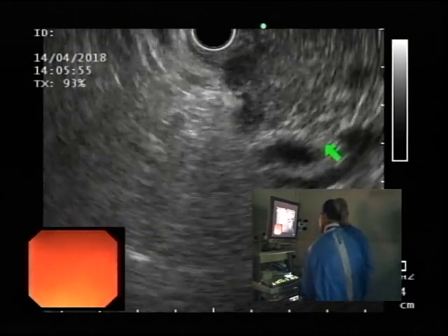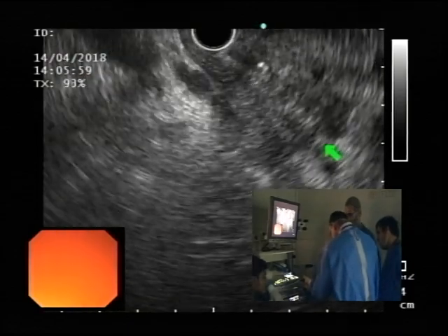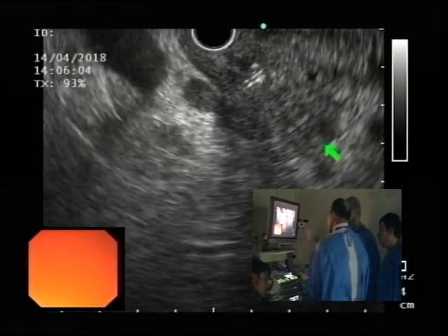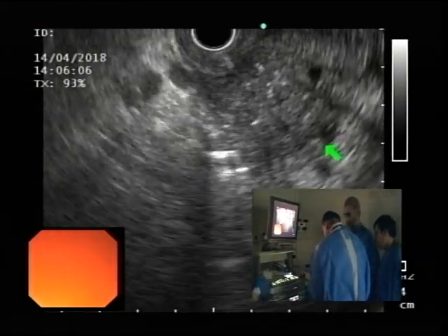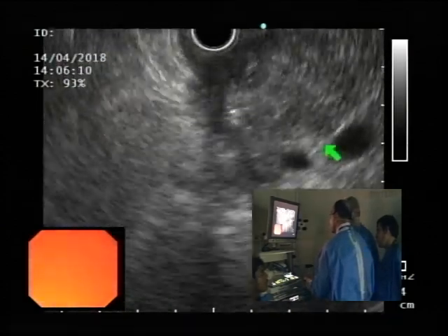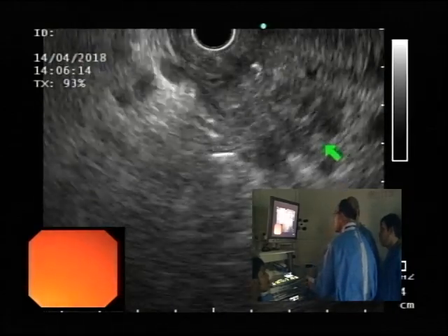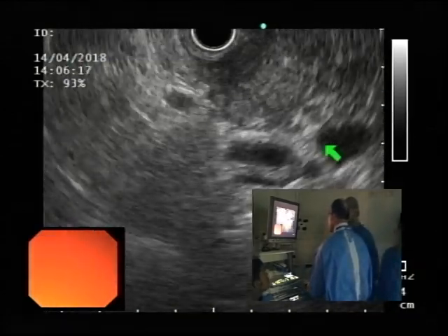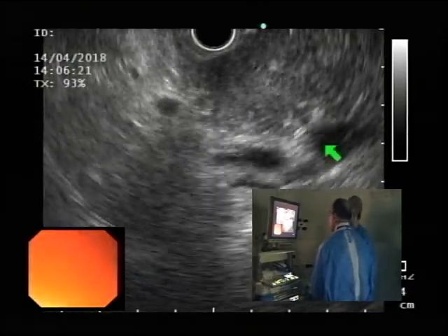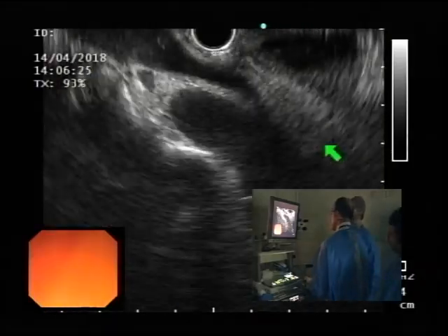What I would like you to do is ये mass है. Thumb down. ये body position maintain करें मेरी तरफ. You're facing this corner. मैं अपने fellows को ये कहता हूँ कि तुमने उस तरफ नहीं देखना, इधर को देखो. And then support with your hand, left hand, right hand, और ऐसे करके clockwise, counter, and gently pull करना है till you can identify the bile duct and pancreatic duct. इसमें obviously pancreatic duct आपको ये थोड़ा सा नज़र आता है, and bile duct is when you go more counter.